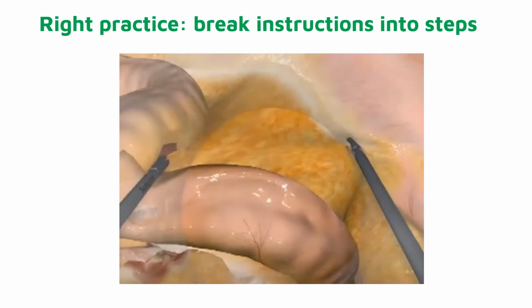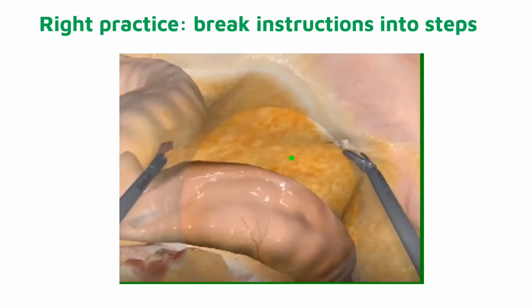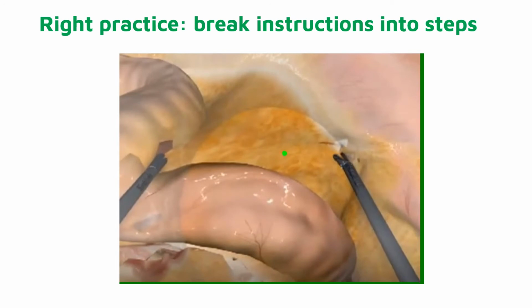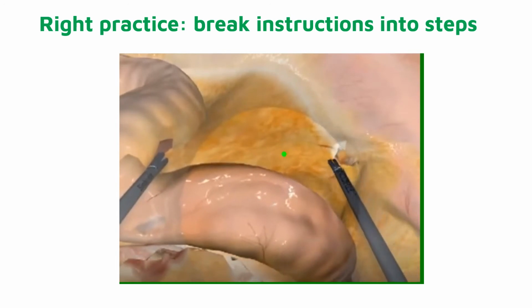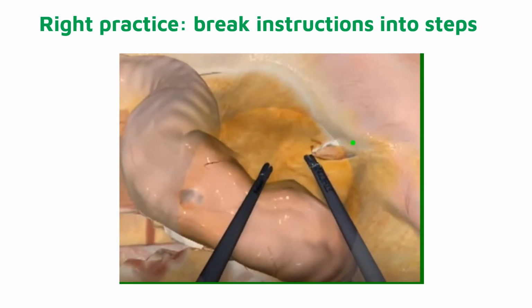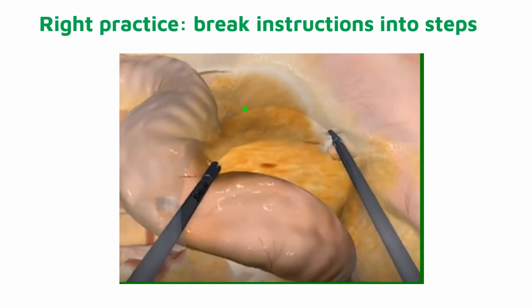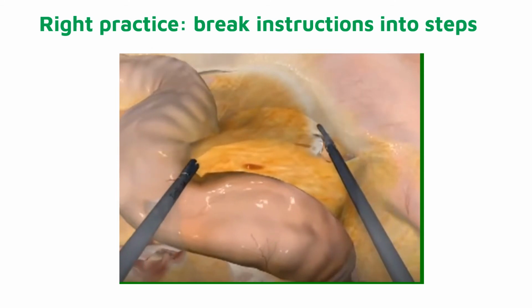Now here is a right practice of breaking a large chunk of instructions into small steps. So with your non-dominant hand, I want you to grab this tissue right around here and pull it to the left. And with your dominant hand, cut right along this tissue. Perfect.